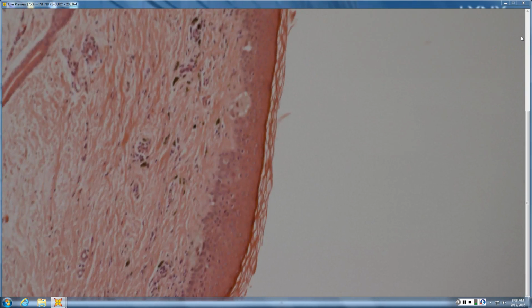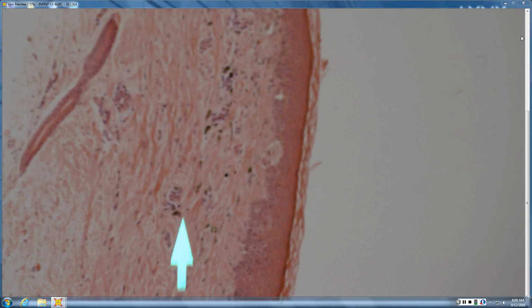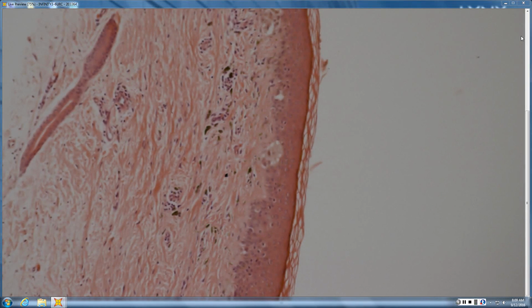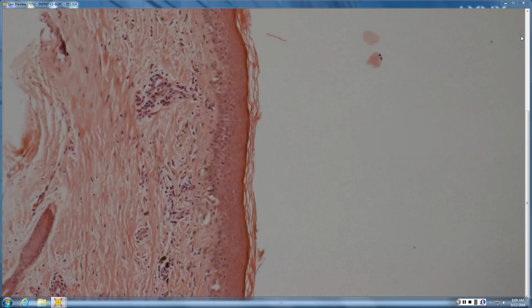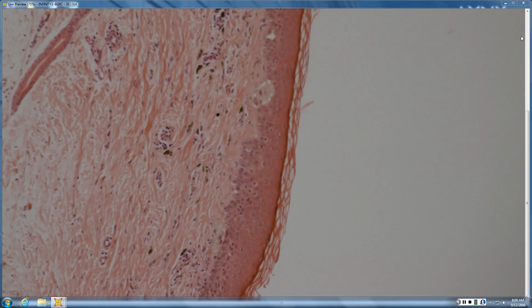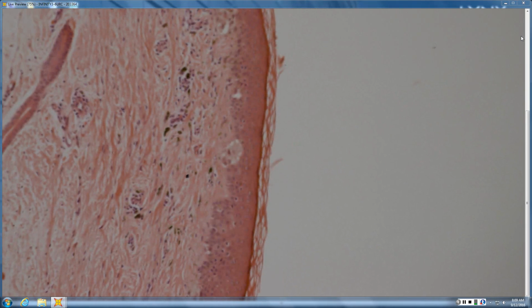Okay, David. Looks like we get some pigmented cells that are sort of perivascular. They seem to be hiding out along the vessels. Yeah, and then the question would be, are those melanocytes or are those just melanophages? And when they're perivascular like that, probably just melanophages, right? How about at the junction? And then at the junction, looks like we've got sort of a scattering of melanocytes. I don't see any confluence, really. So no confluence. You do have nests, and are the nests beautifully, evenly spaced, all similar in size and shape, or do you have more of a syncopated Latin beat here?